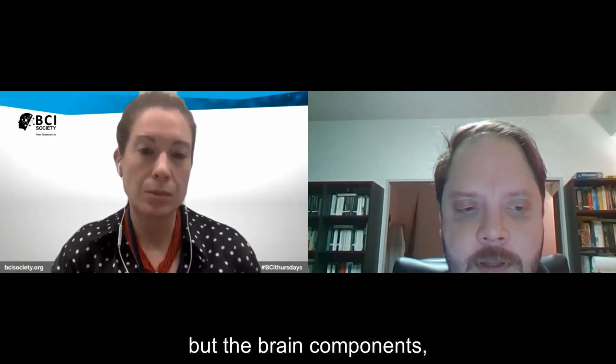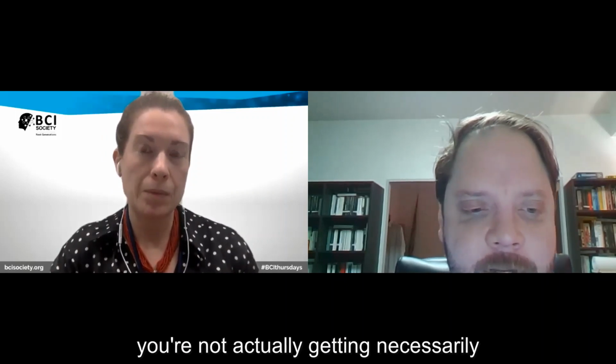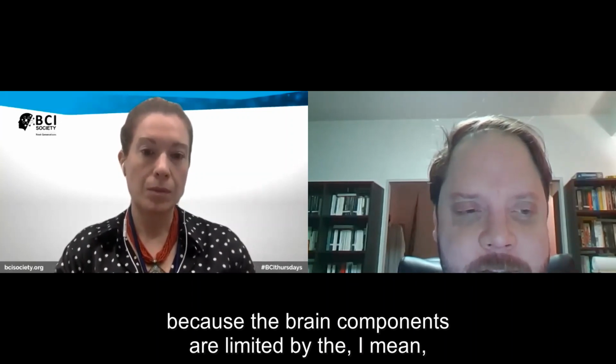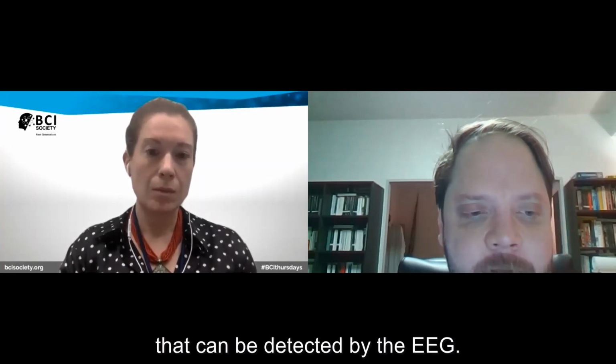But you're not necessarily getting more brain components, because there's only a limited number of sufficiently strong neural synchrony events that can be detected by the EEG.